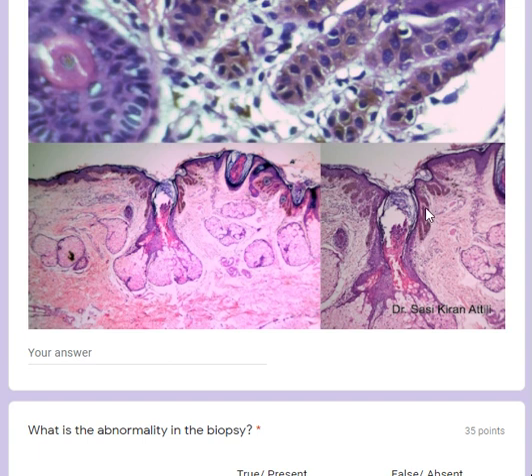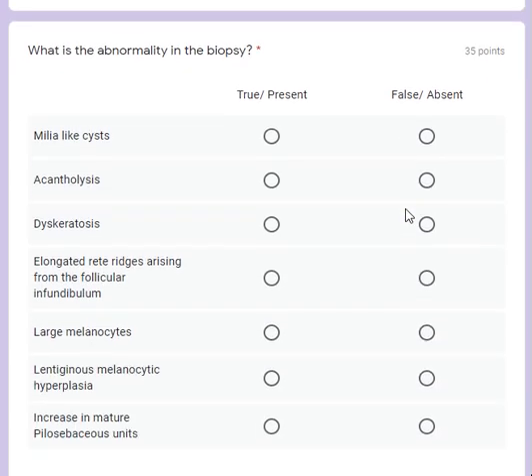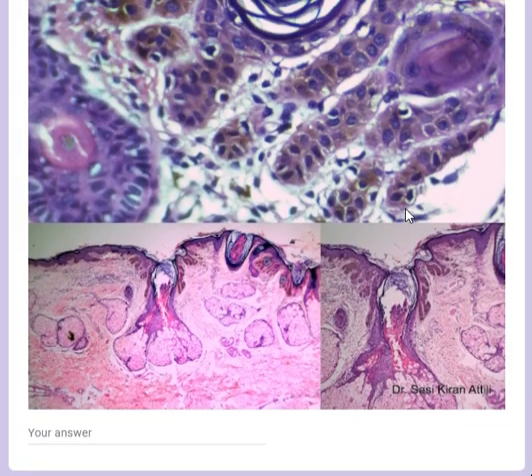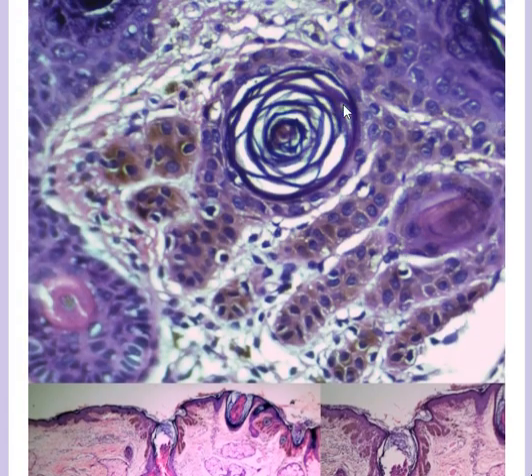This is a typical picture of Dowling-Degos disease, particularly the follicular variant. In the non-follicular variant, you also see these sort of elongated rete ridges, but they're not restricted to the infundibulum. The abnormality seen here in this biopsy includes what you're also seeing: milia-like cysts.